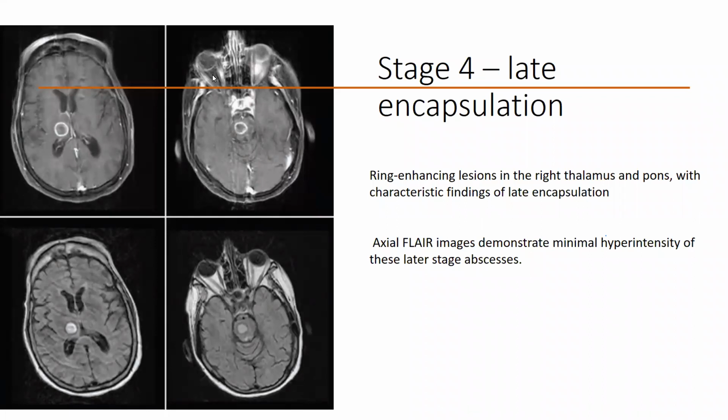Who wants to take the question? Lipid peak in MRS, sir. Size, number, size. MRS you can say at the end, no?